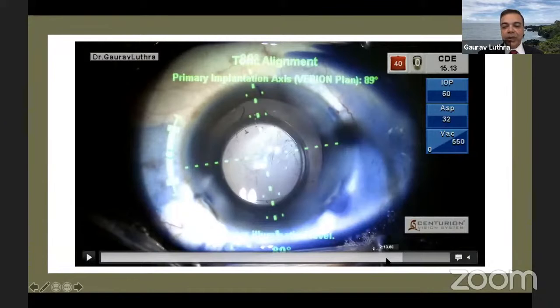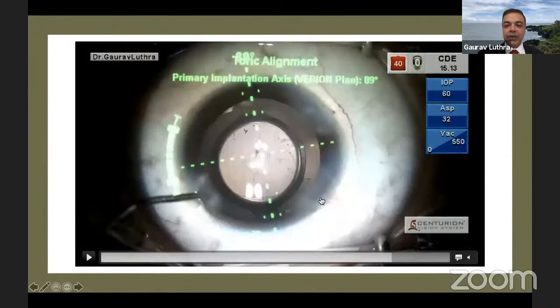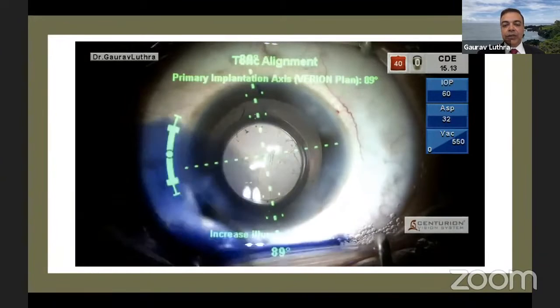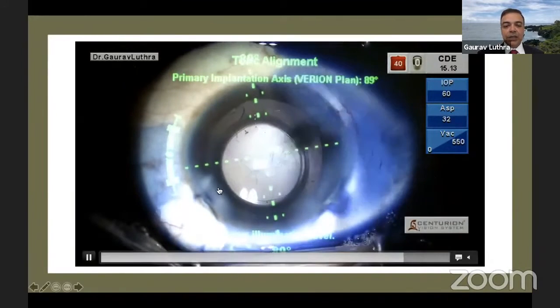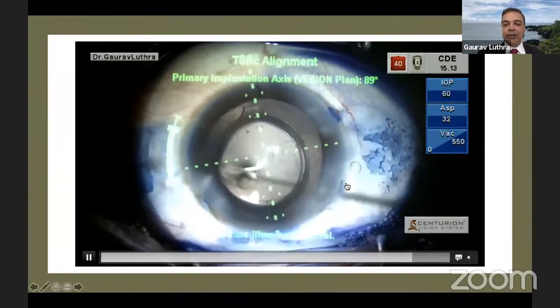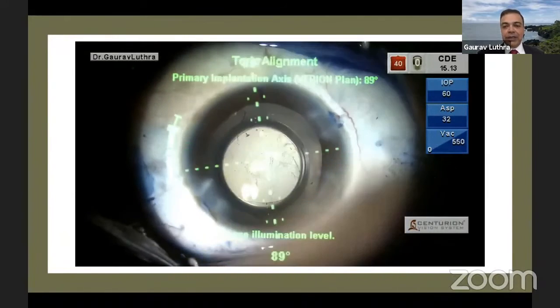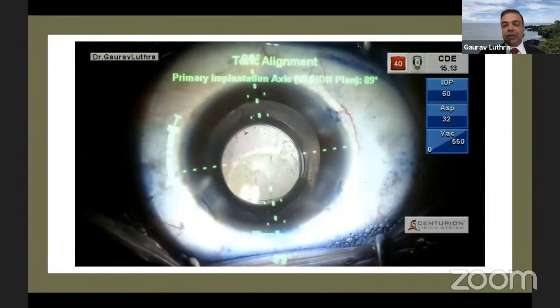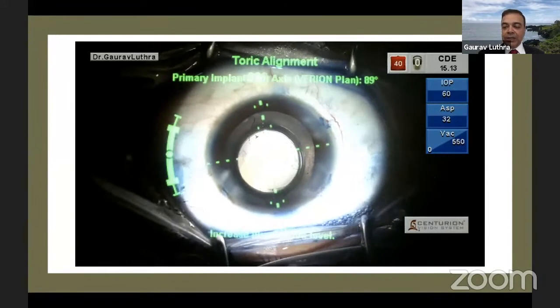I do this for all pediatric cataracts, or even adult cataracts where there is a possibility of wound leakage, because if you see a small stream of fluid, as you can see on this spot, you can then go and hydrate it again. It's very simple and it works very effectively. I've been using it for many years, along with intracameral moxifloxacin, and then checking the pressure of the eye with the finger, as Dr. Blumenthal used to do. So these are a few of the pearls.